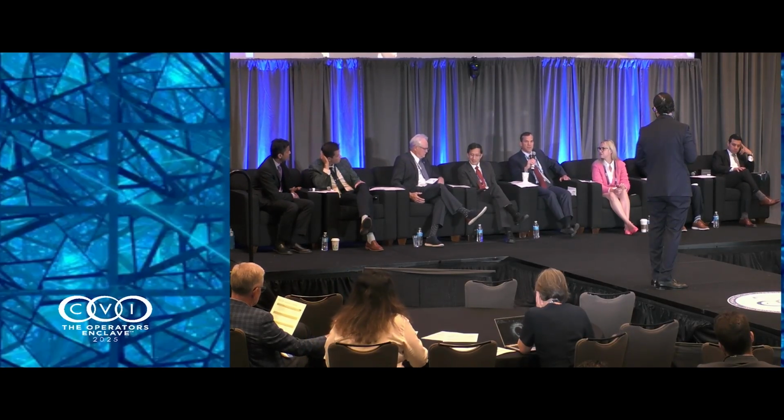Yeah, I agree completely in that we're doing it the same way. Just to let people know, as Karim showed you, you basically put a little plus sign on the lesion in the 3 different views, and it's really key. It reminds us to do a good angiogram, with minimized panning, making sure you really lay out the vessels well. As long as you do that, the system automatically traces. We try not to adjust it at all unless there's an egregious error, which usually there isn't. And then within a minute after that, you have your answer. So it is very quick.